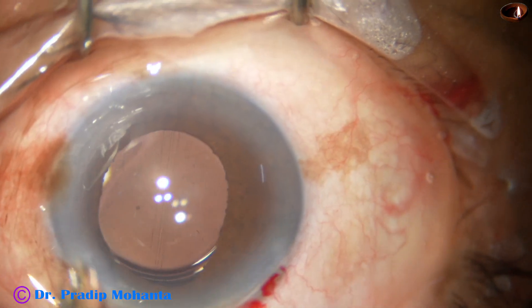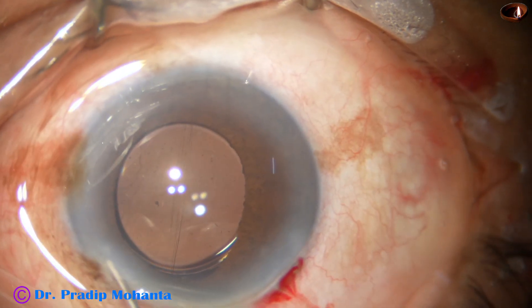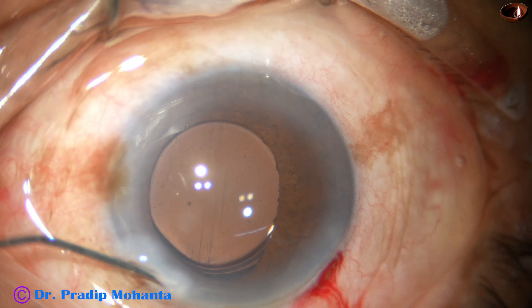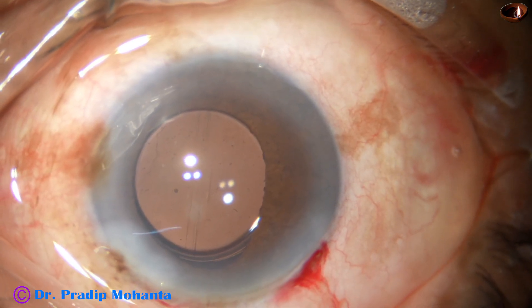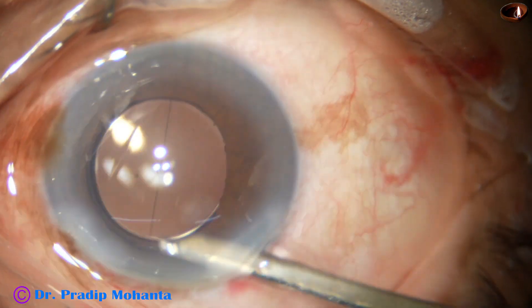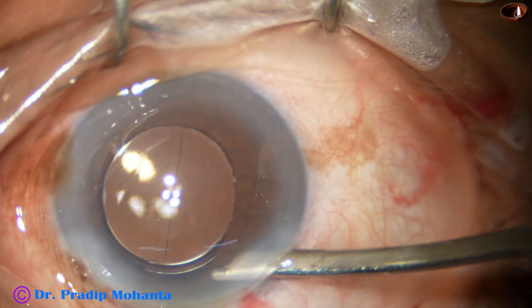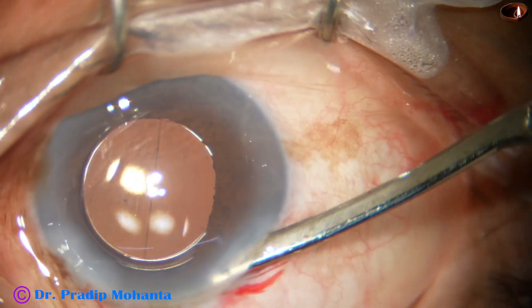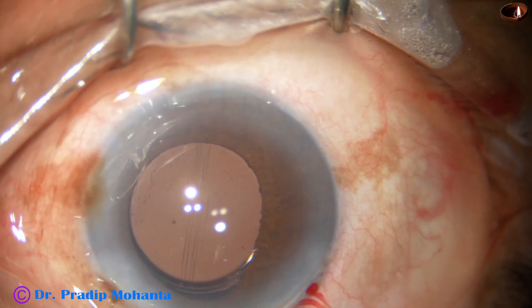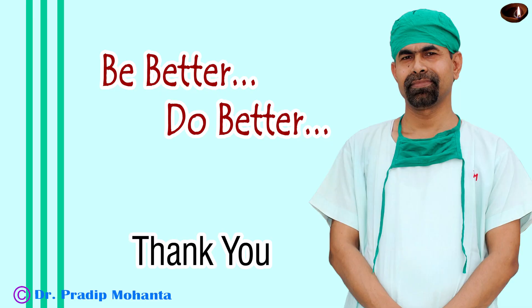Now moxifloxacin, closure of the side port, and then a final lavage of the anterior chamber. The anterior chamber is nicely formed. Integrity of all the wounds is checked and the case is concluded.